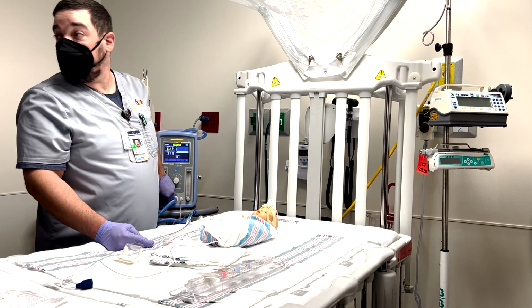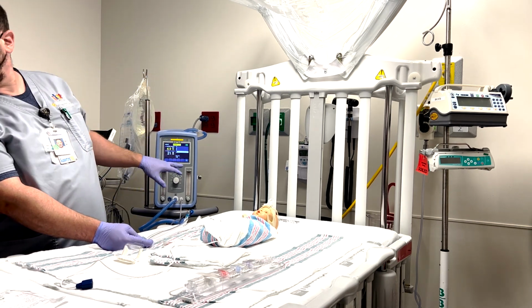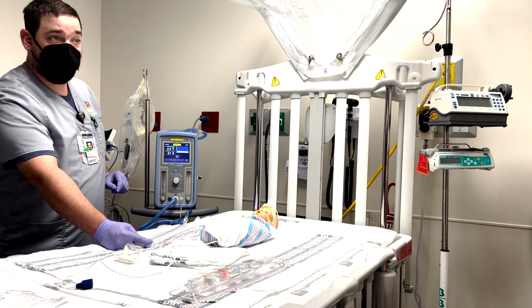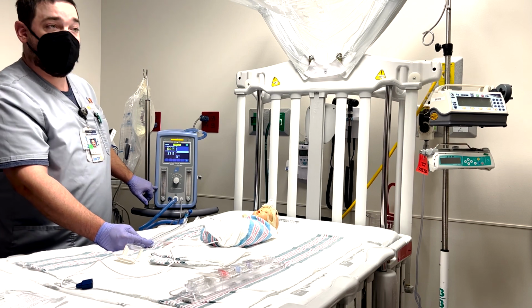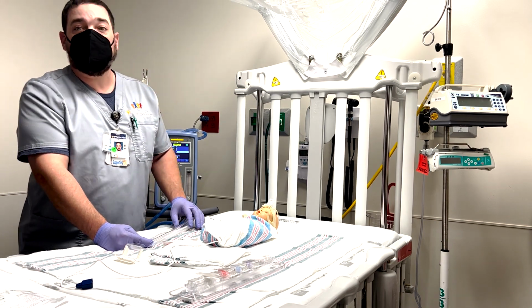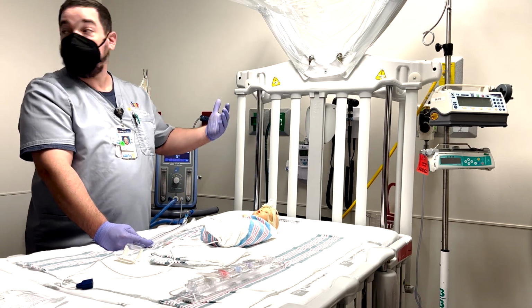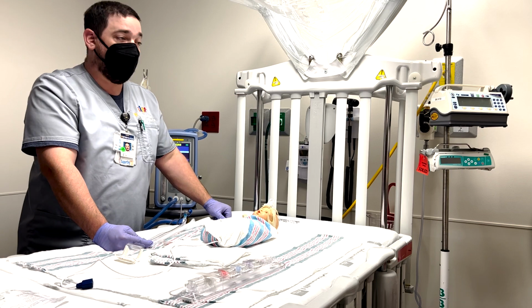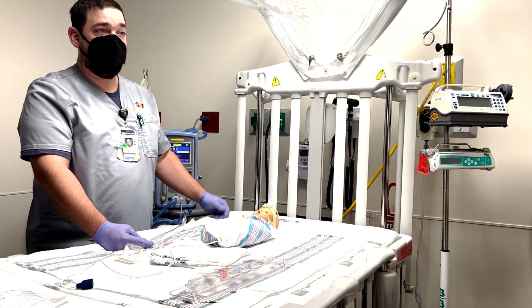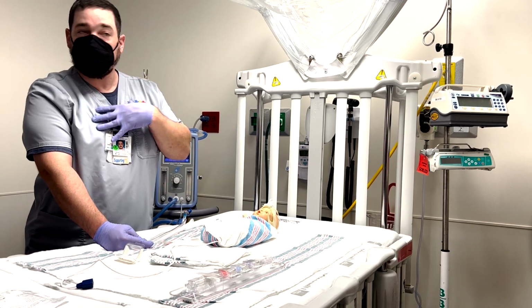And I am going to cut the flow and the graphics. Everybody got an eyeful? That sort of thing. That's really all you're reporting. That's what I do when I make notes. This flow here is nice. It's more for the respiratory therapist's edification, to see how much flow it's taking to get a certain number of PEEP. If I have a flow of 11 to get a PEEP of 5, all that's telling me is I probably got a pretty big leak somewhere. Okay, that's for us to worry about.